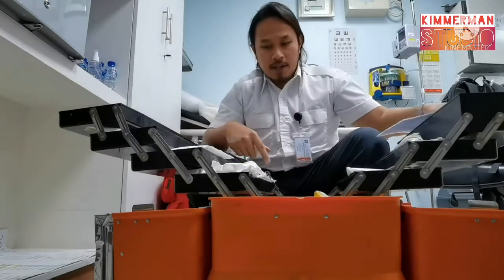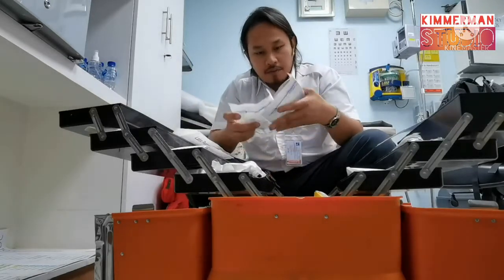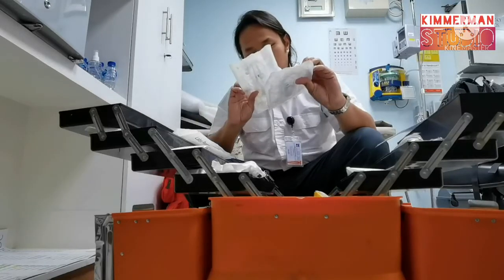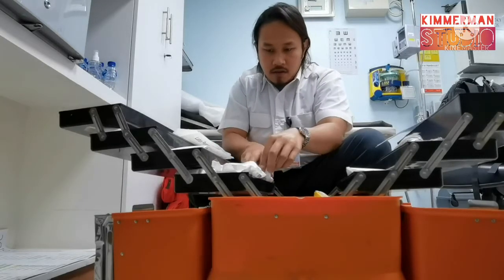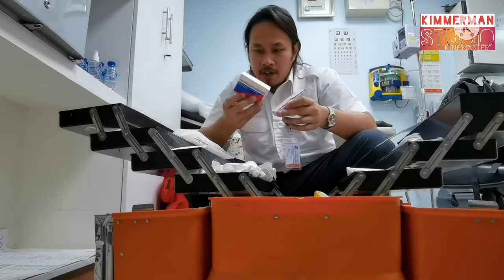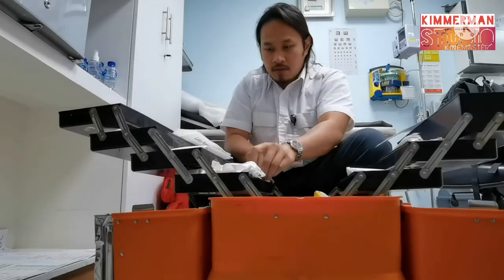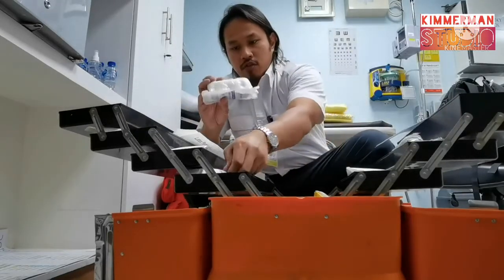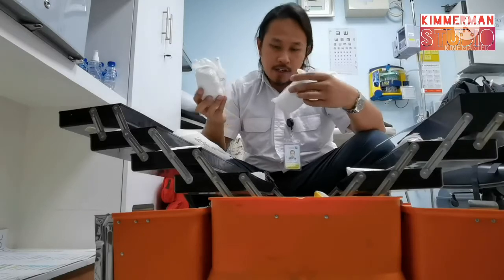Okay. Last, we have this IV infusion set. Not expired. Regular bandages again. Two. Not expired. And gloves. Not expired.